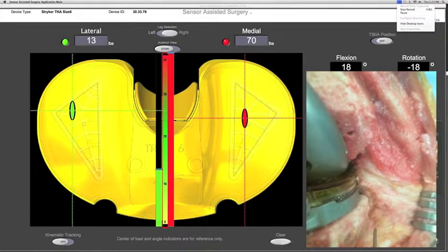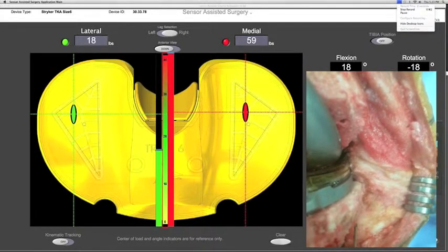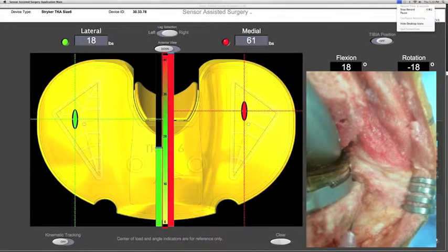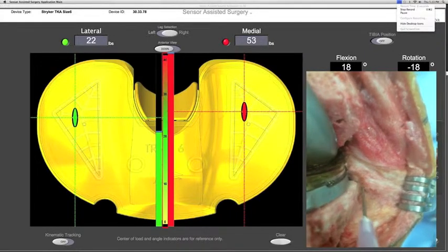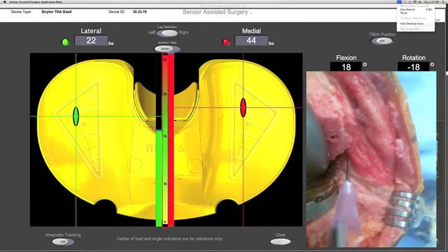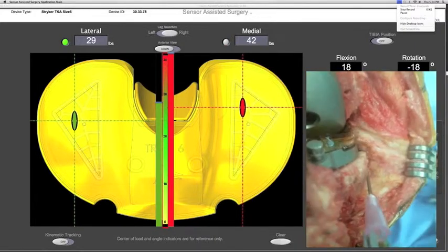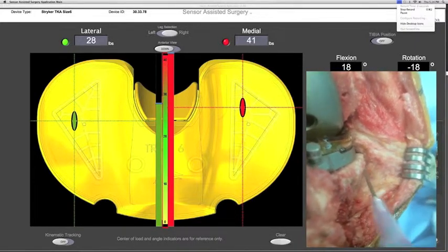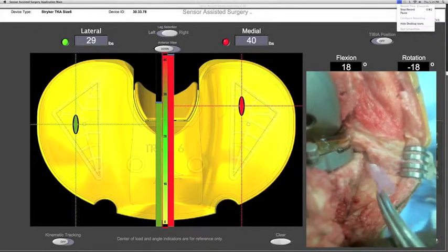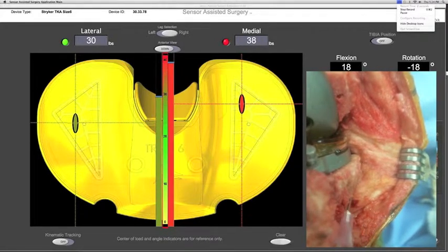Now utilizing the graphic user interface, the surgeon positions the knee to expose the medial structures. After palpating the tight structures, a technique similar to Bellamons' in which an 18-gauge needle is used to sequentially pie-crust both the superficial medial collateral ligament, the pes anserina insertion, as well as portions of the tight deep medial collateral ligament at the joint line are performed. The graphic user interface allows the surgeon to use dynamic real-time data in order to tension the ligaments.